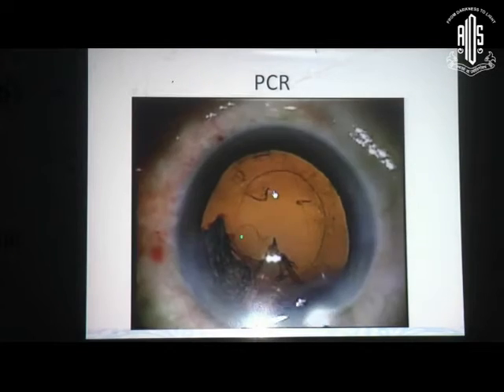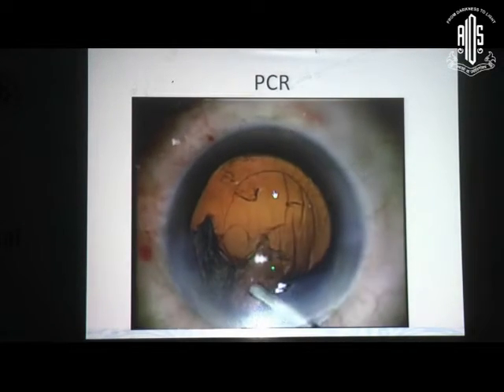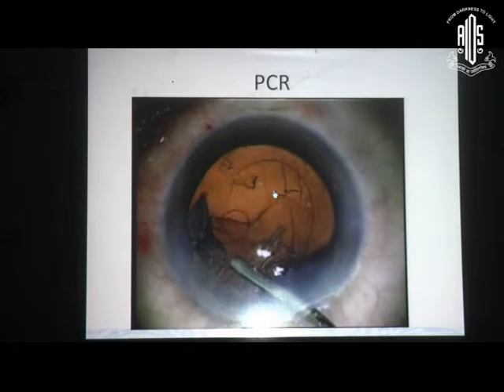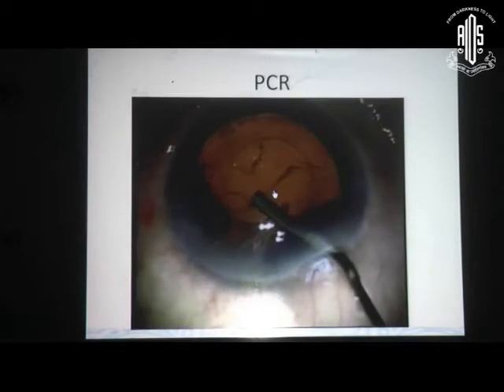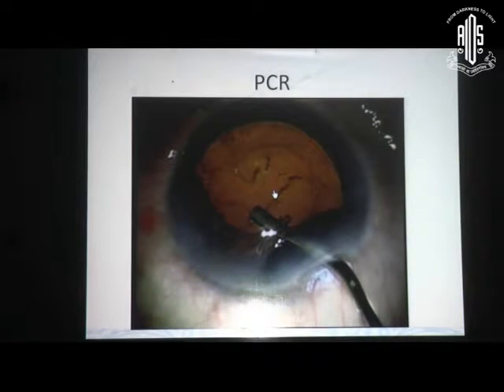Here, I have produced a round PCR. Now, why does this happen? This is important for you all to learn. When I am going to use a 100% stereo coaxial system, my depth perception is going to go down.